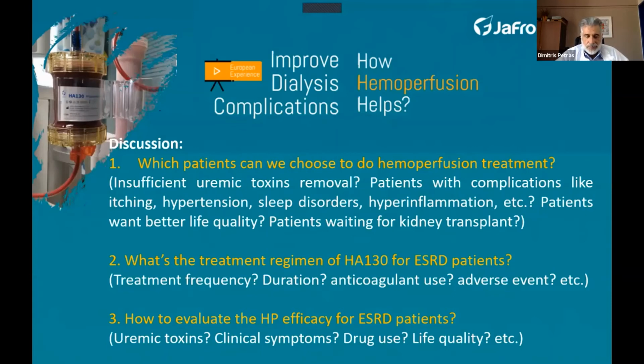Thank you. Alina, please. For intensive treatment, the recommendation is for patients with longer dialysis years and with complications such as renal osteodystrophy, poor nutrition, skin itching, peripheral neuropathy. The recommendation is 4 times monthly, changing to maintenance treatment after conditions have been controlled. For patients with shorter dialysis years, for preventive treatment of patients without dialysis complications and after intensive treatment, the recommendation is 1 to 2 times per month.